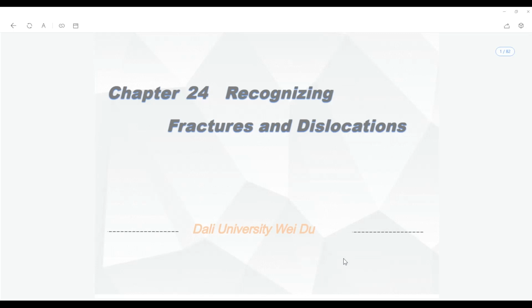Try to understand, since this is one of the most frequently prescribed X-rays, very often you find that without a skeletal radiograph, a radiology department does not work. The most important reason for taking a skeletal radiograph is pain. If it is coming from physiological, non-traumatic conditions, you can call it arthritis, osteoarthritis, rheumatoid arthritis, or inflammation of the bones.